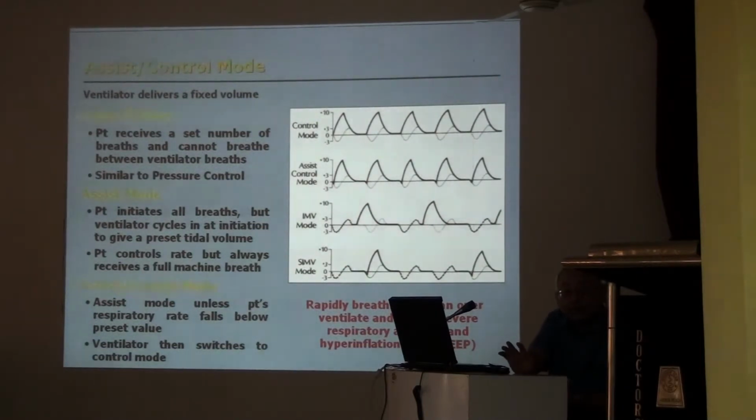My minute volume has fallen to 3 liters per minute. I need a ventilator. So what to do? My lungs are okay. My demands are all met. Only because of the narcotic influence, my volume has fallen to 50%.